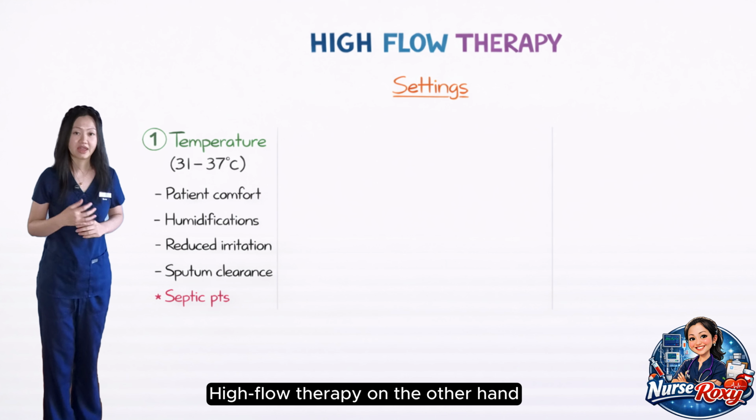Now, most ventilators do have a high flow mode, although the setup is slightly different, but the theory is the same. So let's look into this together. There are three main settings of a high flow therapy.